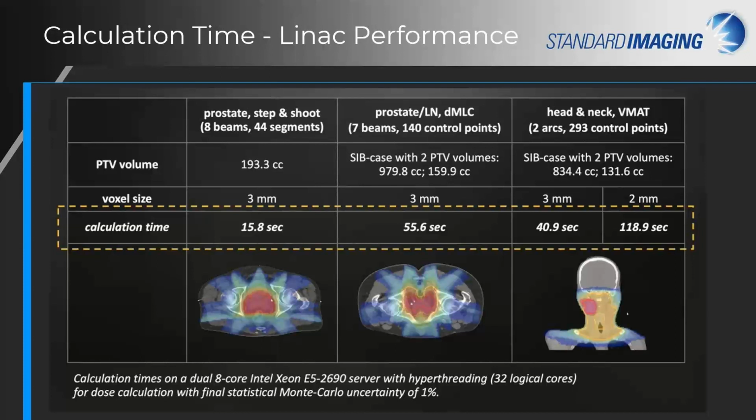So to meet that challenge, SIMOCA focused on optimizing every element of the Monte Carlo algorithm to accelerate computation times without relying on really expensive hardware or GPU cards. With SIMOCA and IMSure 3D, we're now at a point where the calculation times are imminently feasible and manageable for QA purposes within the clinic.